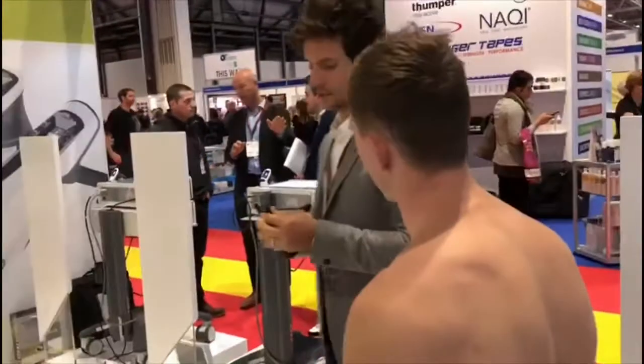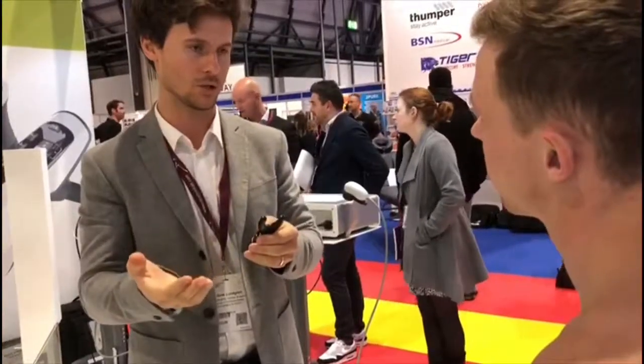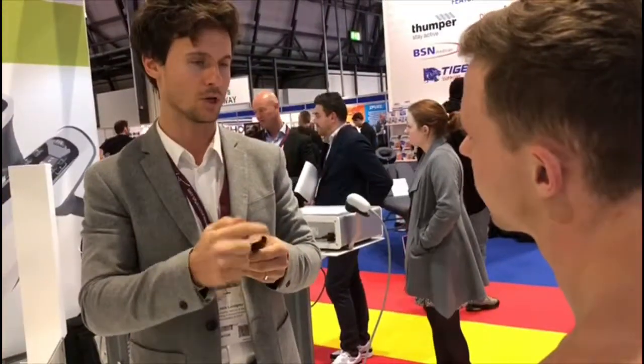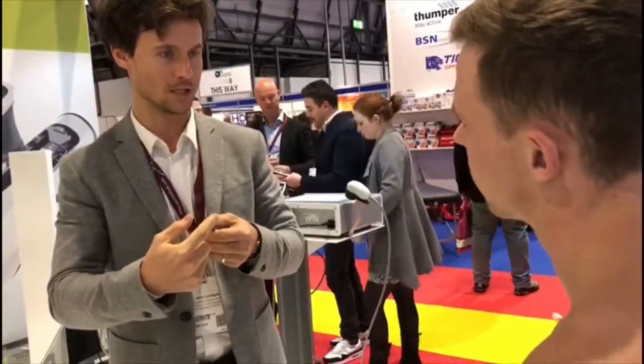This is called the spine actor. It is actually aiming towards the joints. You can use it to mobilise the joints, and you can also use it to treat the muscles on each side of the spine. But I will use it to mobilise the joints.